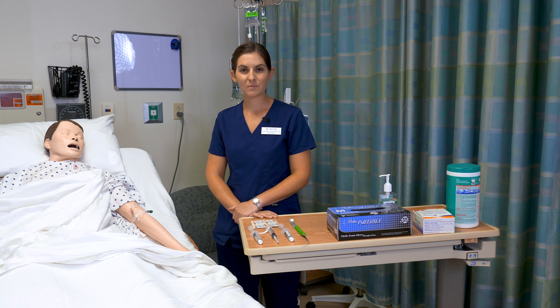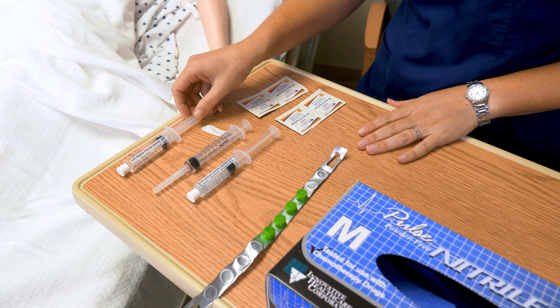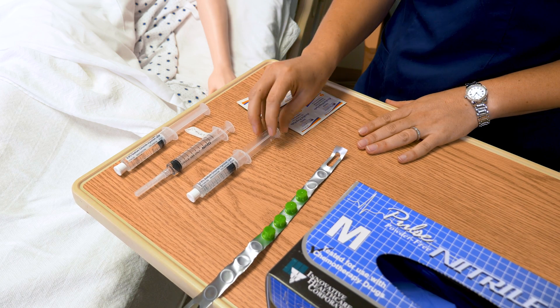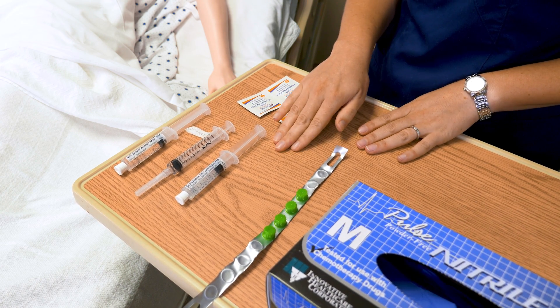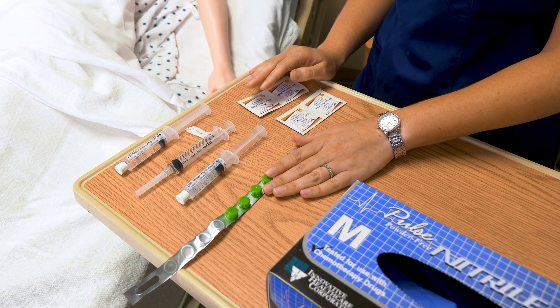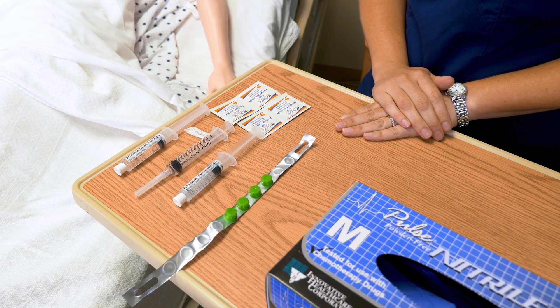I'm going to start by demonstrating how to flush a peripheral IV line. I have gathered my needed supplies. I have my first saline, then my medication to administer, then my second saline. Because this is a peripheral IV I do not need heparin. I have my curos caps, a new one, and then I have my alcohol swabs to scrub the needleless connector.